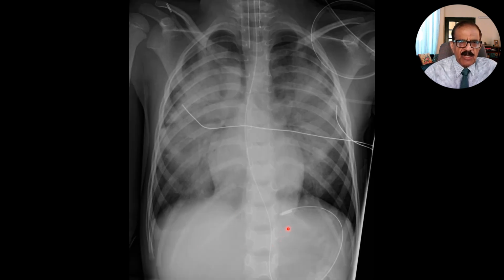This is another patient with even denser shadows. I think they are very typical, just like the previous one, but there are two differences. Number one is that these shadows are much denser than the previous one. And number two, heart size is not large at all. So if you have normal heart size but a pulmonary edema-like picture, you may suspect non-cardiogenic pulmonary edema, or bilateral pneumonia is also a possibility.